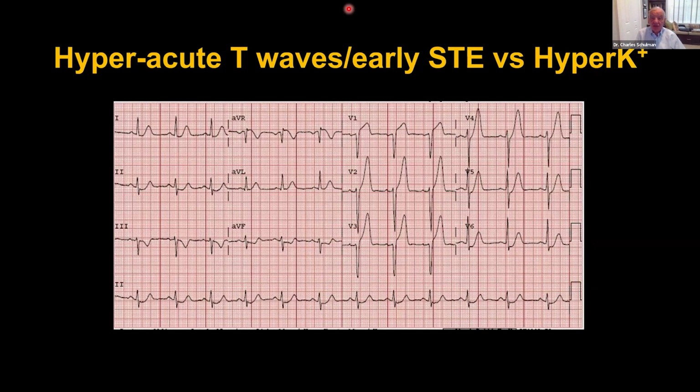Hyperacute Ts or hyperkalemia? No takers? Quiet group today. Well, okay. No takers.